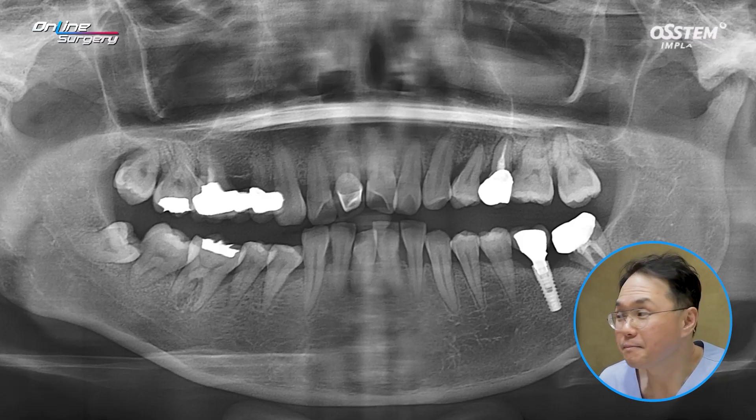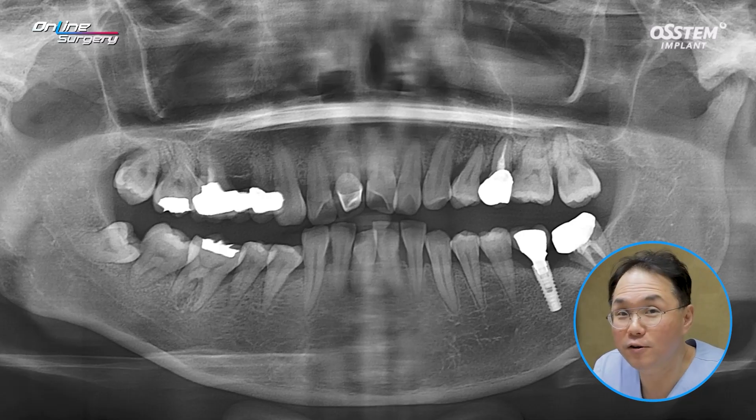If you look at No. 4, the distance to the canal is sufficient. However, in the case of No. 6 and 7, especially No. 7, the residual bone up to the canal is very limited. In this case, delayed placement can be done rather than immediate placement.